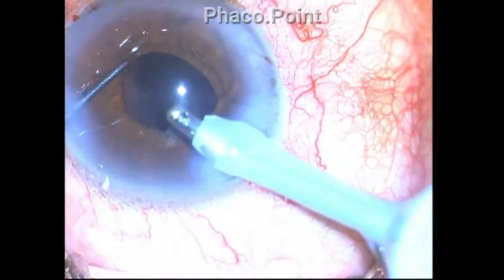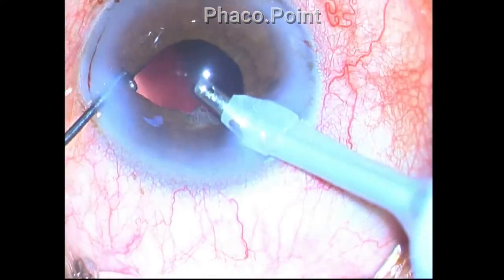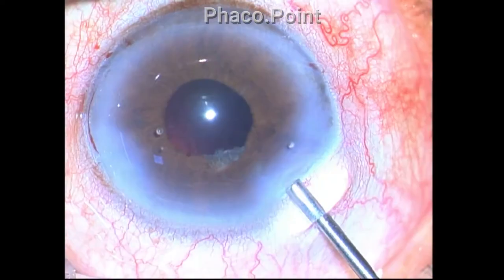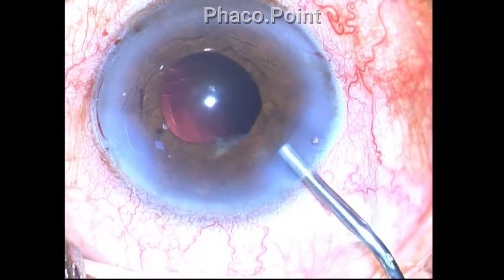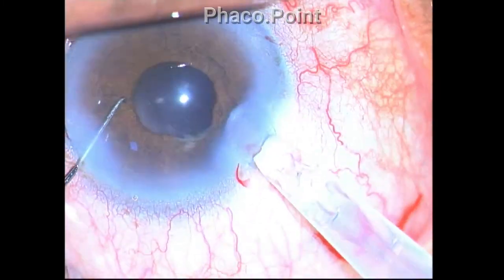The entire bag is now totally clear of cortex, and I move to the final step of implanting the intraocular lens — a hydrophilic acrylic IOL implanted within the capsular bag.